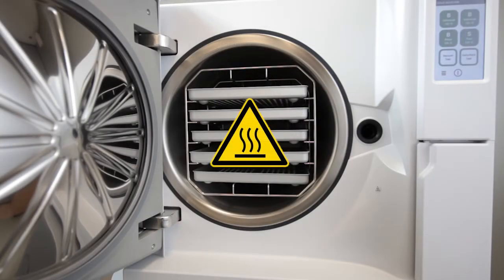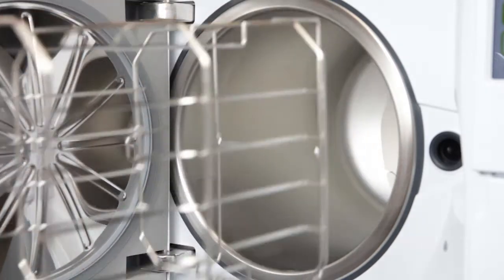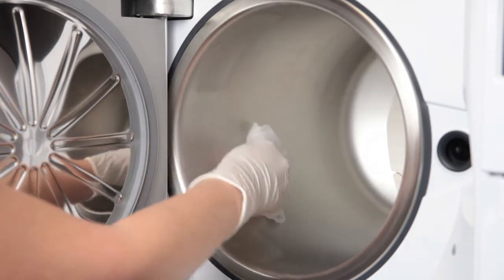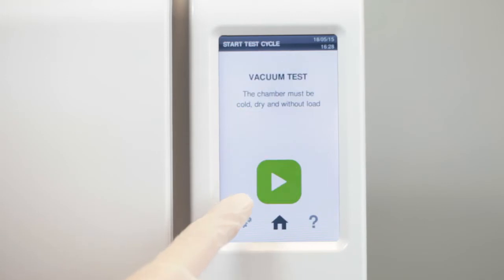Before carrying out the vacuum test, make sure that the sterilization chamber is completely dry and cold. Remove the rack and all storage trays. Check that the sterilization chamber is completely dry, then close the door and select vacuum test from the cycle selection screen.